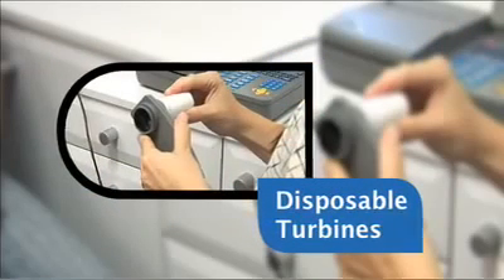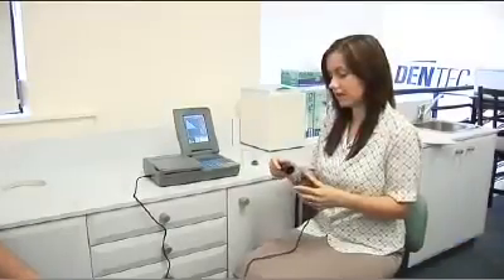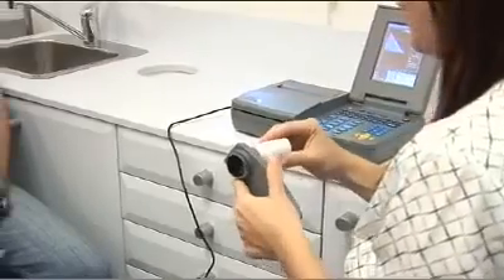Using disposable turbines will bring your practice to the forefront of respiratory infection control, as well as allowing your SpiroLab 3 to analyse the patient's inhalation. This enables you to confirm maximal effort and that you are getting true FVC readings.